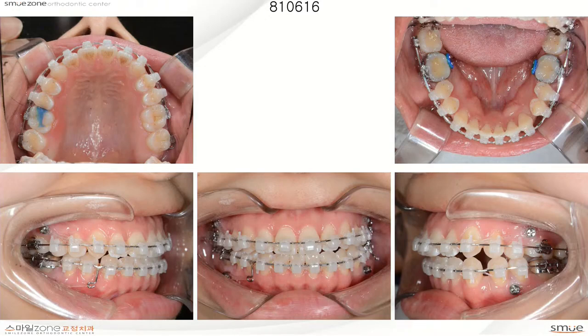And we used the mini screw to retract on the right side and protract on the left side, to give a more class 1 relationship.